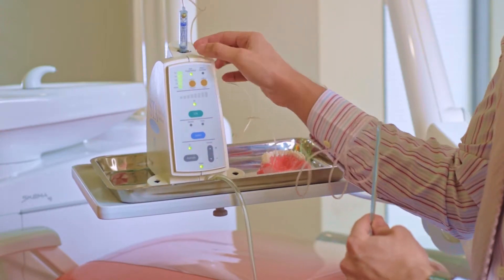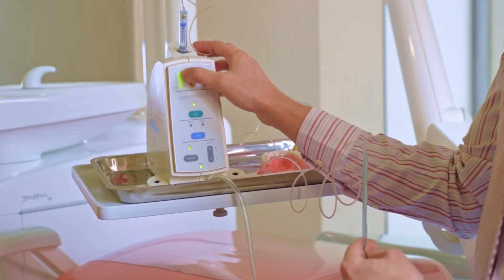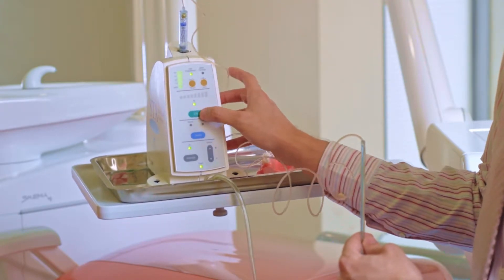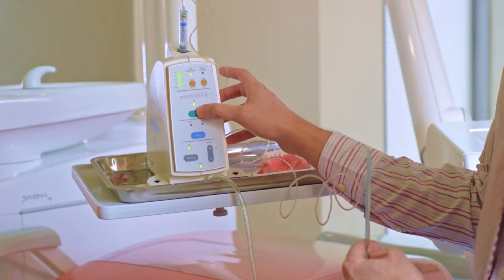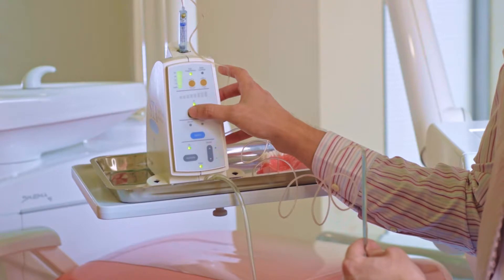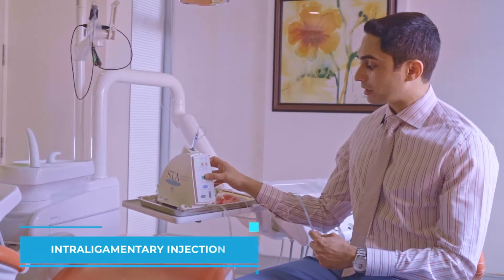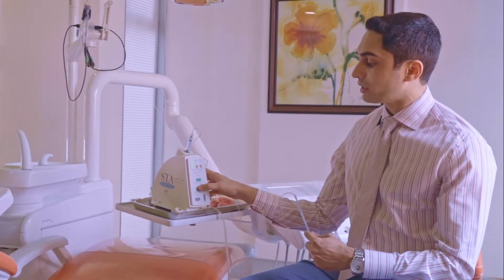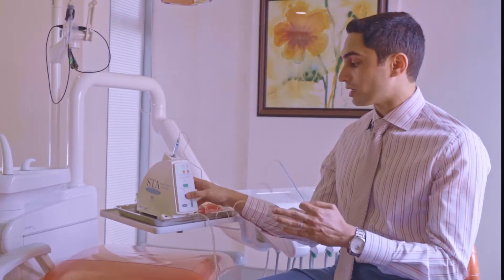The display shows how much local anesthetic is still left and how much you have remaining. The STA mode is on, which means it's the Single Tooth Anesthesia mode. Specifically, it's giving you an intra-ligamentary injection — not an infiltration, not a nerve block. You select either Normal for regular local anesthetic delivery, or Turbo if you want to go fast. You can only use Turbo if the patient is already numb; if not, start with STA mode.